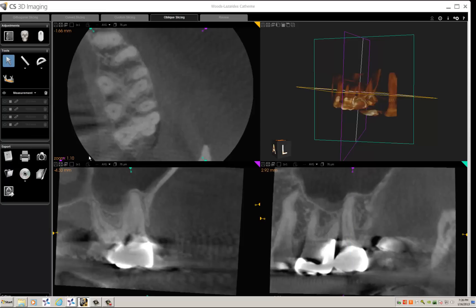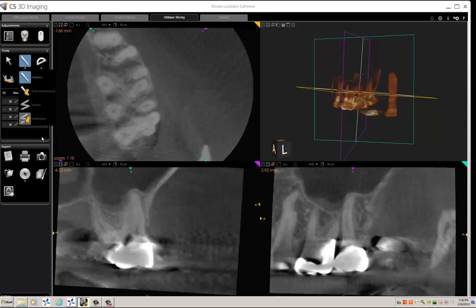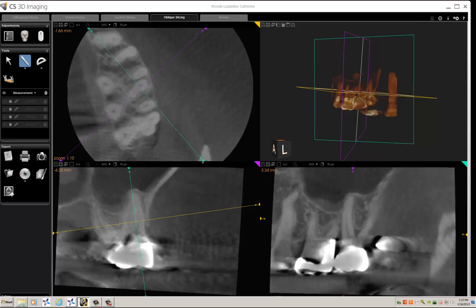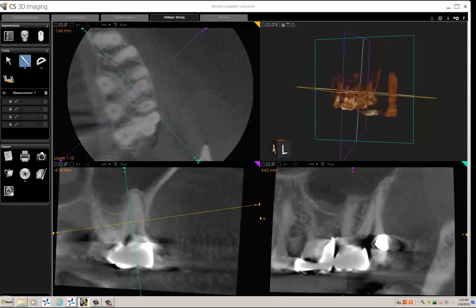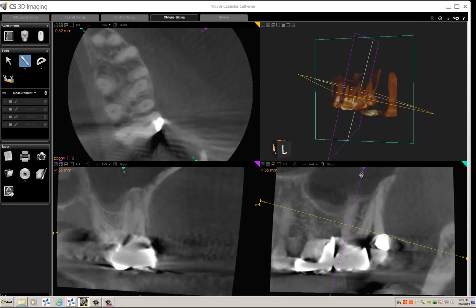Let's remove that so you can see it better. You can also do multi-plane and polyline angles if you don't want to go in a straight line, but this is actually pretty accurate. Then I'll take my sagittal slider and move it over to the MB2 root. As I do that, please notice what happens in the sagittal view — as you bring this over, the other root comes into play, and you can see it right here.